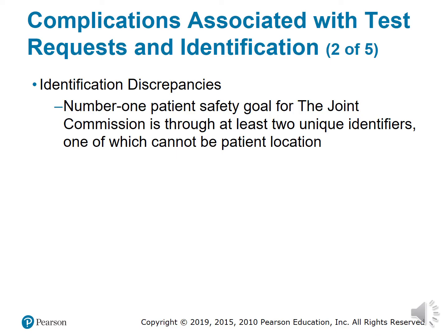It is important for the phlebotomist to wash their hands before and after blood collection, and if a sink is not available, always carry hand sanitizer with you until you can get to a sink and soap to wash your hands. It is also important not to open supplies or sterile equipment before you are ready to collect a sample. If the packages, band-aids, needles, tube holders, etc. are open ahead of time, they may become contaminated and could lead to an infection in the patient themselves.